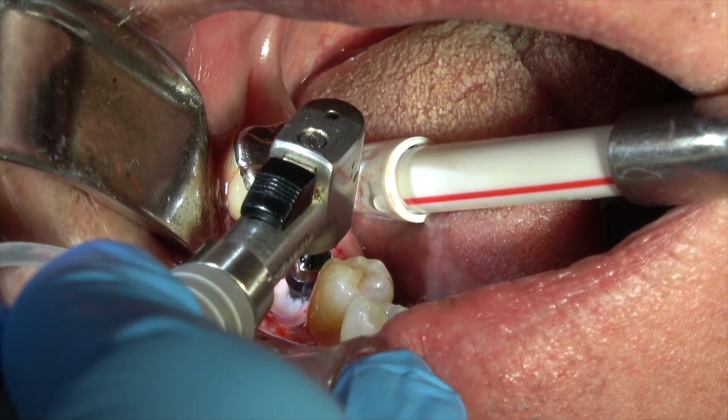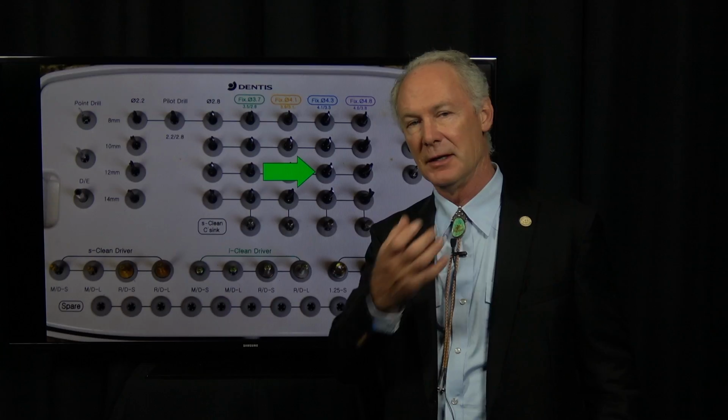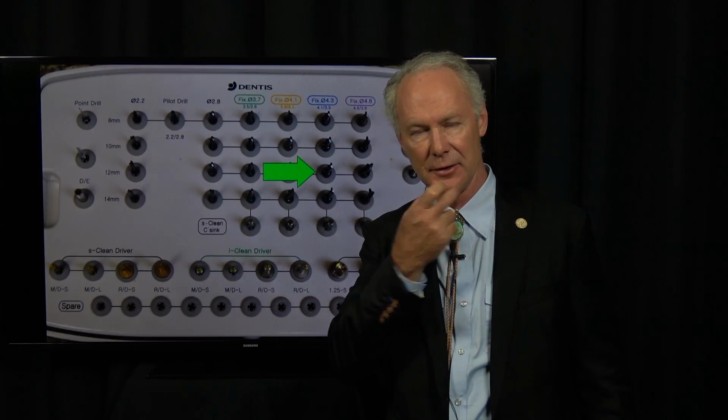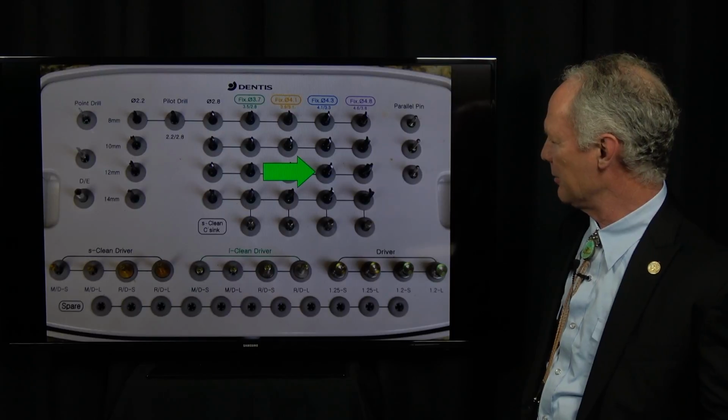But I'm paying attention to be sure I've got at least 1 millimeter of bone on the facial and the lingual of the drill. Another thing to remember is the mandibular bone is a lot harder than the maxillary bone. So the hardest bone in the mouth is the mandibular anterior. The second hardest is the mandibular posterior. The third hardest is the maxillary anterior, and the softest bone in the mouth is the maxillary posterior. So this is a harder bone than that bone in the maxilla.